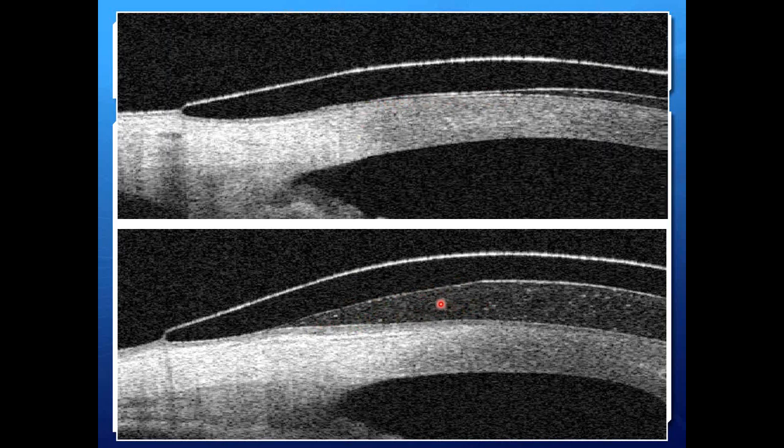Notice the increased vaulting both through the peripheral cornea and limbus, but also by adding clearance zone, you've added 125 microns more sagittal depth. So if you would then have an excessive amount of apical clearance, the lab can just compensate by modifying that next zone in the lens and dropping the center ever so slightly.